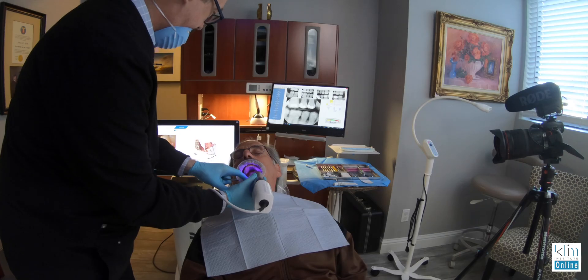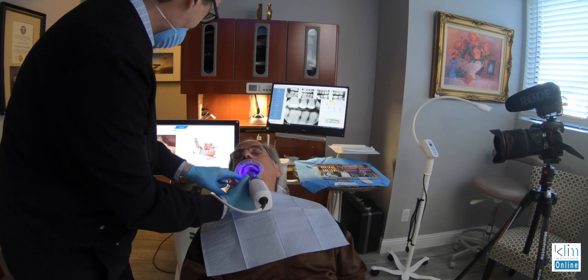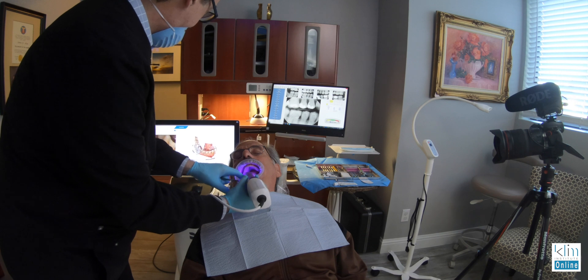Hi, how are you folks doing? This video is about the three factors that really make my CEREC CAD-CAM system work well in my clinical theater, and it happens before I ever take a scan.